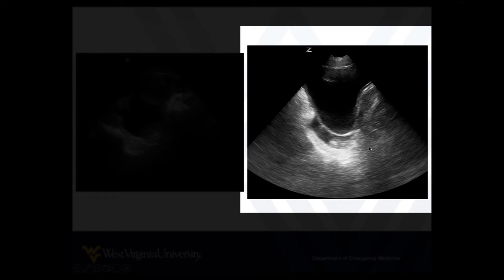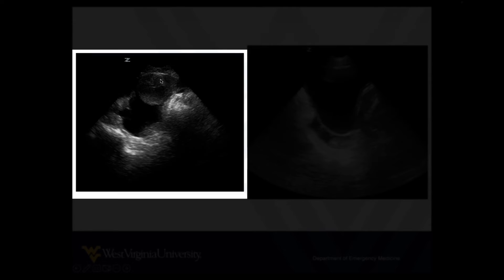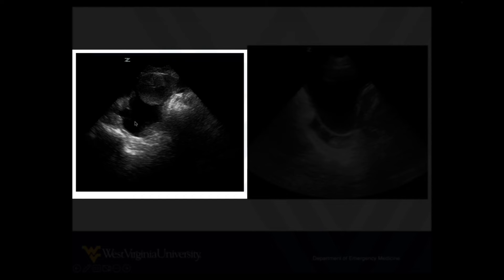When you get to the pelvis, fan through and examine the bladder entirely — look for fluid, usually behind it, but depending on where you're slicing the view, it could be on top of it. In females, identify the uterus and look for blood behind the uterus. And that's what you see here — uterus, fluid behind.